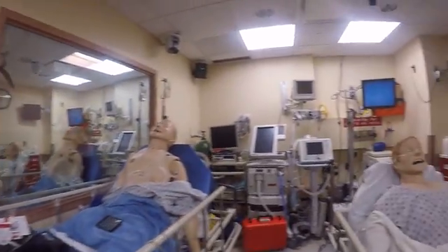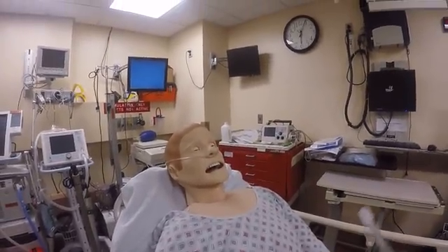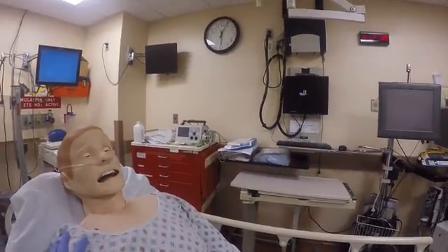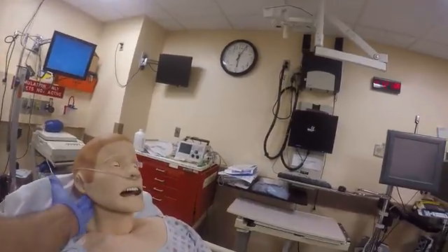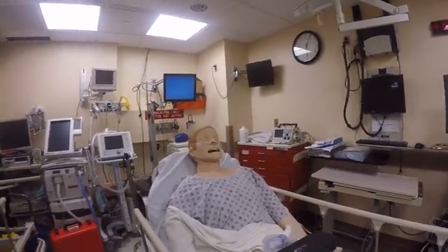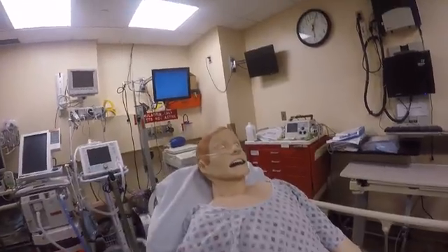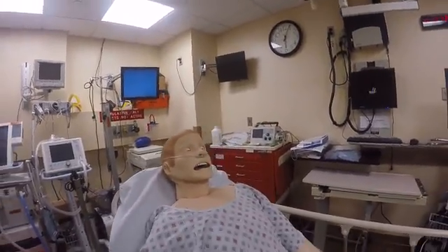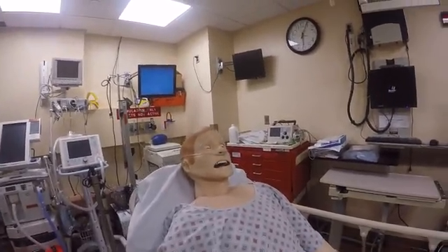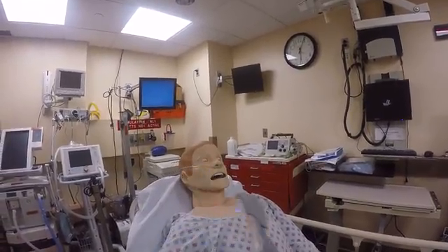Okay, so this is our patient. His eyes are half open, lethargic. How are you doing? No verbal response, no opening of eyes. No movement to painful stimuli. I think this patient may be a candidate for airway protection and needs to be connected to a ventilator — I'm afraid he may desat. I'm going to take advantage of this GCS-3 induced coma state. I'm going to use my video laryngoscope, already pre-loaded, and see if I can intubate with this device.